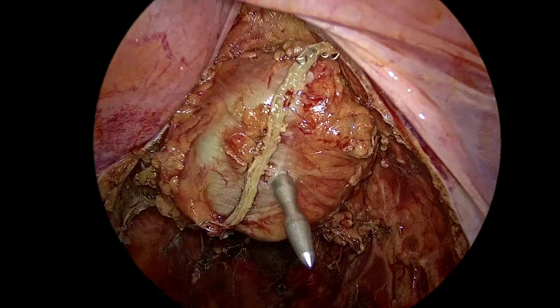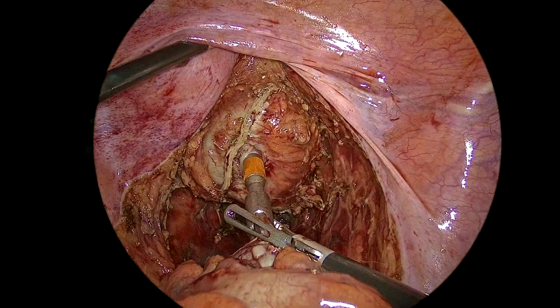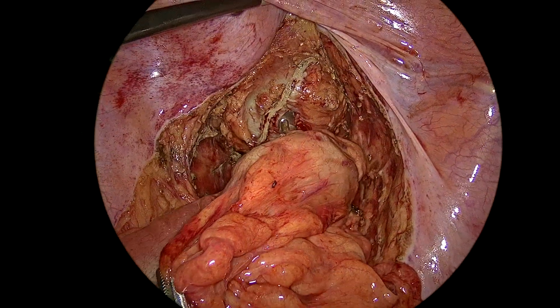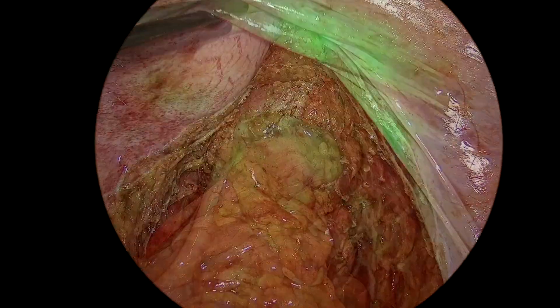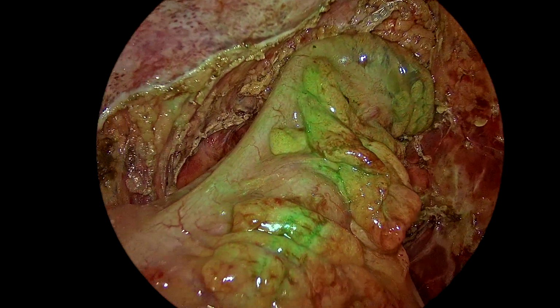End-to-end anastomosis was performed with circular stapler number 29. Recheck ICG again for blood supply at the anastomosis.